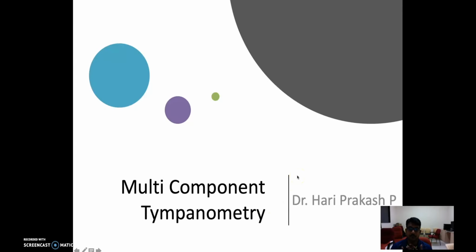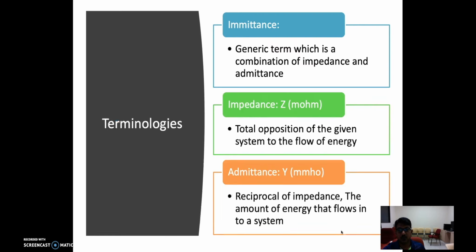Hi everyone. So I'm going to brief you about multi-component tympanometry alone. Actually, it is two parts. One is multi-component and multi-frequency. I'm going to teach you multi-component tympanometry, but then I'm going to leave you with the slides of multi-frequency, which may not be understandable, but then you have some references in that, so you can go through it. If you understand, it's well and good. If you have any doubts, you can come and ask me anytime as usual.